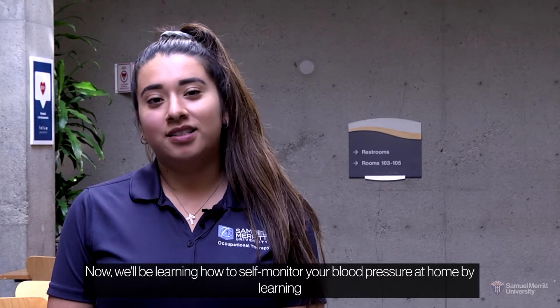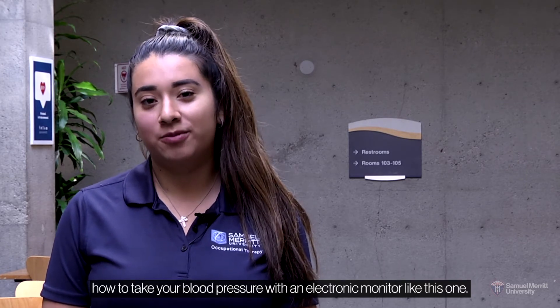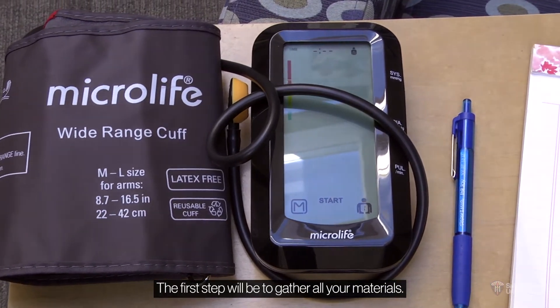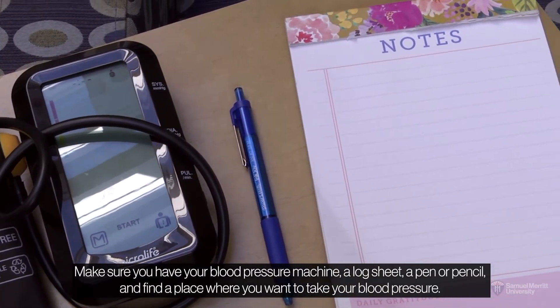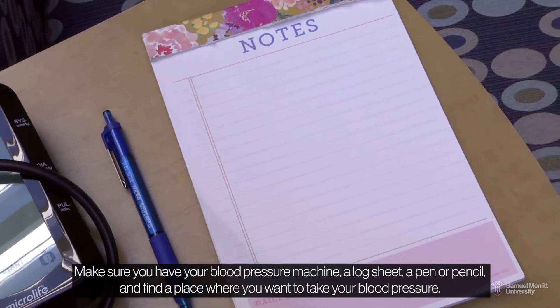Now, we'll be learning how to self-monitor your blood pressure at home by learning how to take your blood pressure with an electronic monitor like this one. The first step will be to gather all your materials. Make sure you have your blood pressure machine, a log sheet, a pen or pencil, and find a place where you want to take your blood pressure.